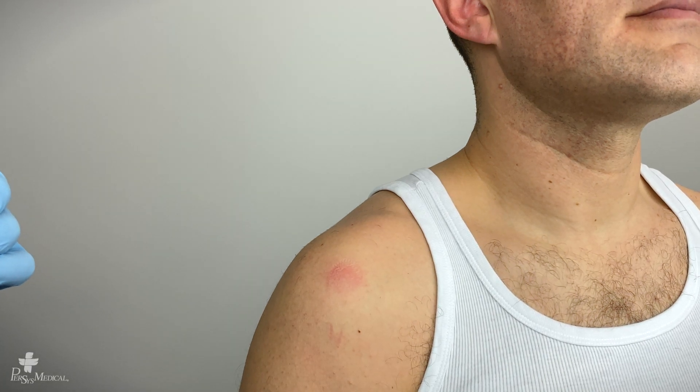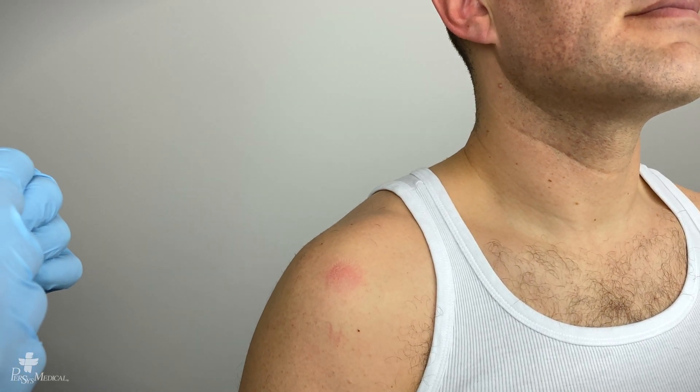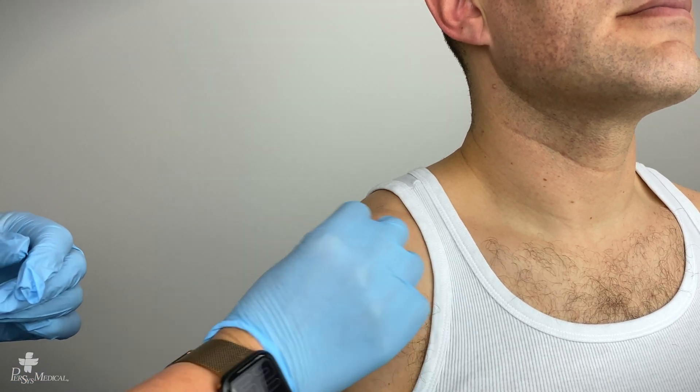Once you have successfully located the insertion site of the proximal humerus, clean per institutional protocol.